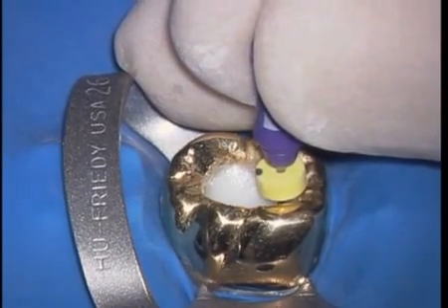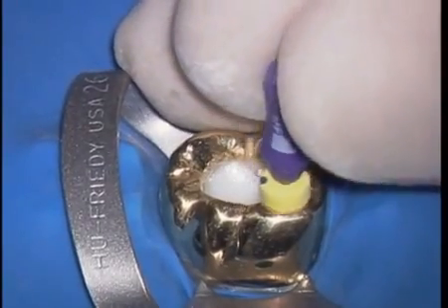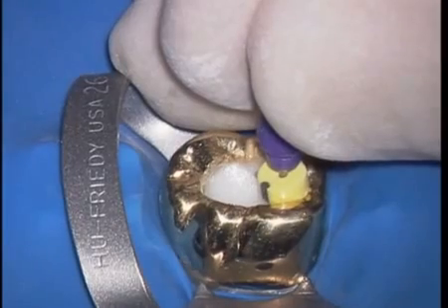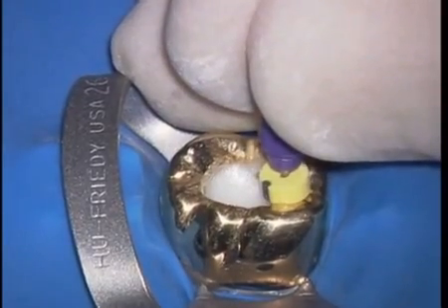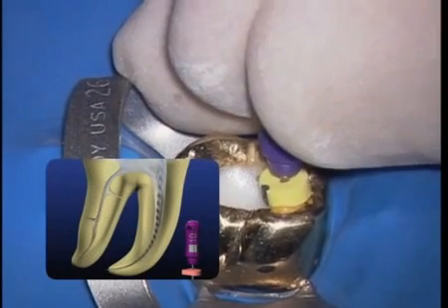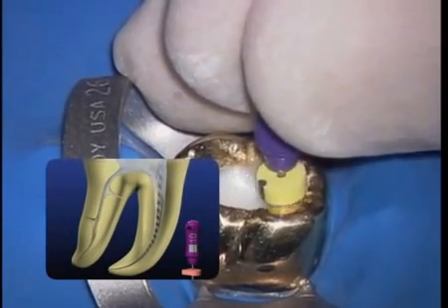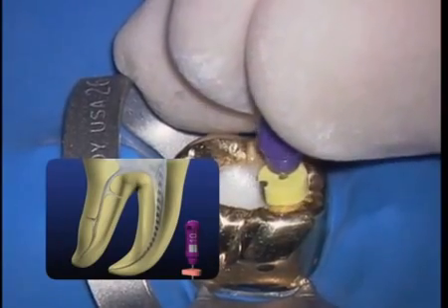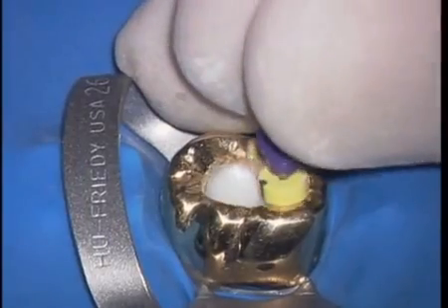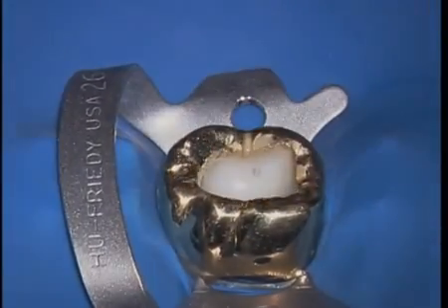Try to slide to length. If you achieve length, don't remove the file. At this level, little short amplitude strokes progressively carry more chelator deeper into the canal. Patency is established by deliberately and intentionally and repeatedly moving the file in short amplitude strokes until the instrument is completely loose. Now take progressively longer strokes to ensure that you have a smooth, reproducible glide path.